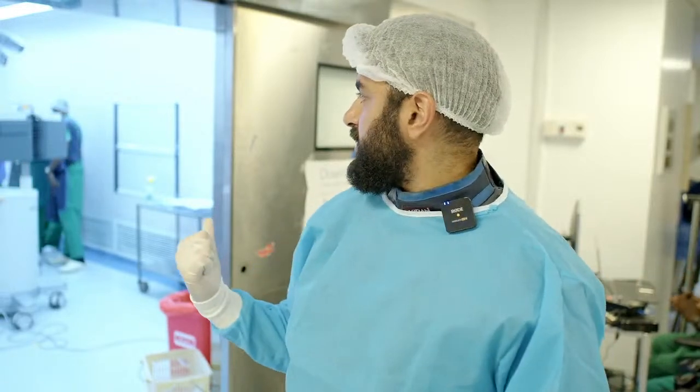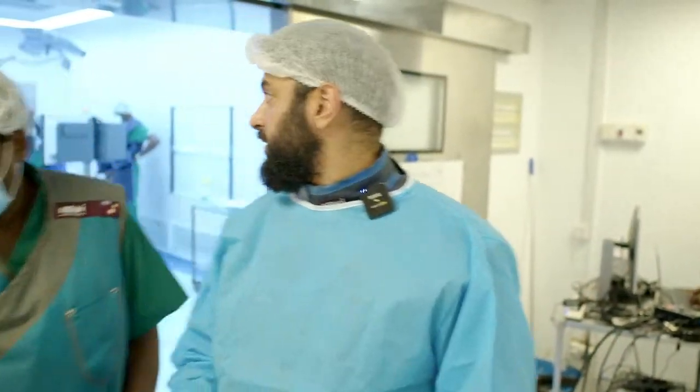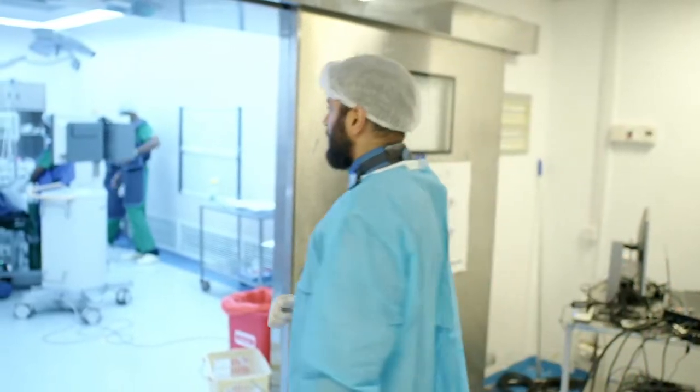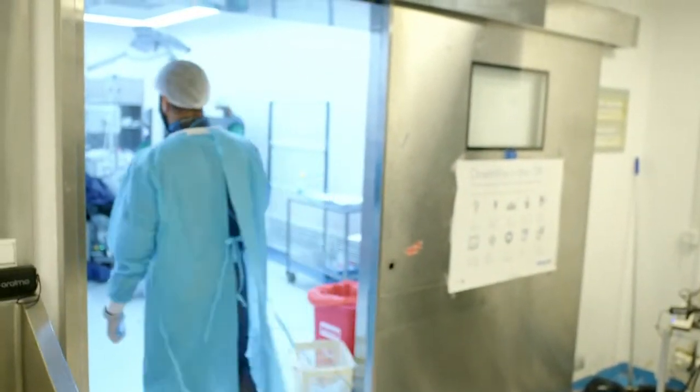We will be using a balloon blocker or a Fogarty balloon. We'll show you how to place the balloon as we do the procedure. The procedure is done under fluoroscopy. So we've got our C-arm and we're going to set it up as I move inside. So if there's no further questions, or if we're all good to move inside, then I think we can start in theater. Good. We're ready?